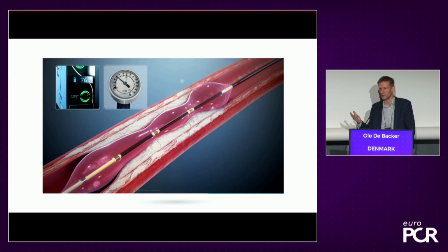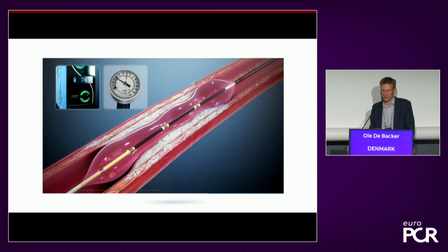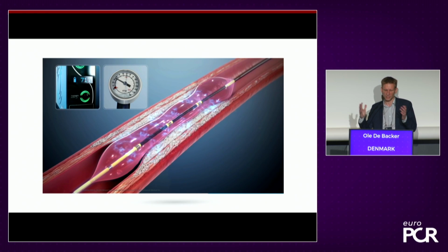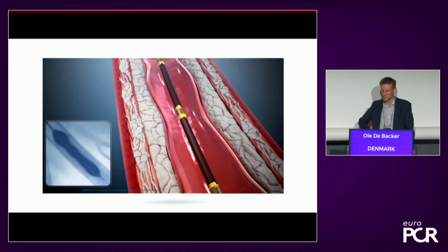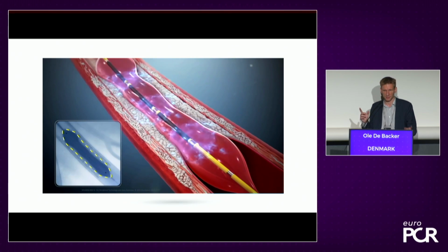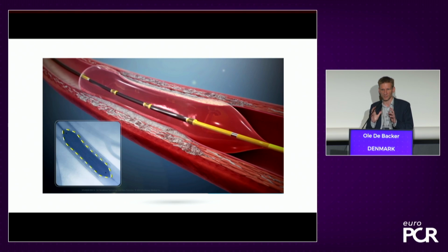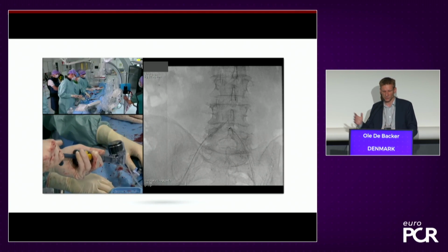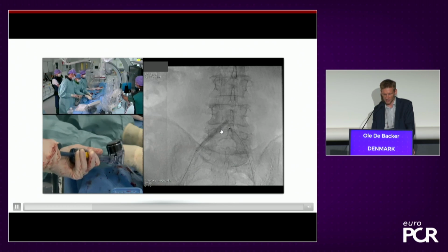And typically with the current TAVI devices we have, it's around 6 millimeter, but then I add 1 millimeter, because there's always a little bit of recoil you can anticipate. So these bursts, I said already, it's 300 pulses in a balloon. It's 10 cycles of 30 pulses, so 300 pulses in total. And here you see, this is the right iliofemoral axis I'm going to use for TAVI.